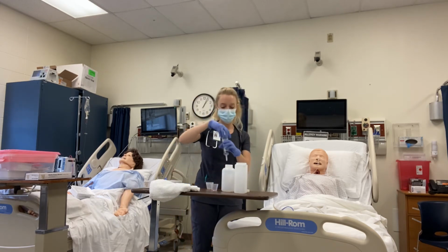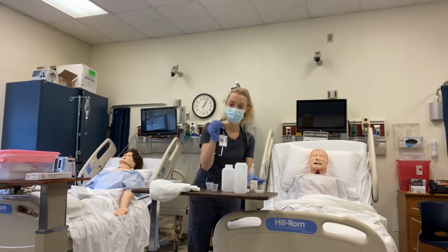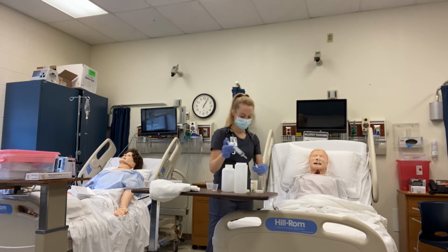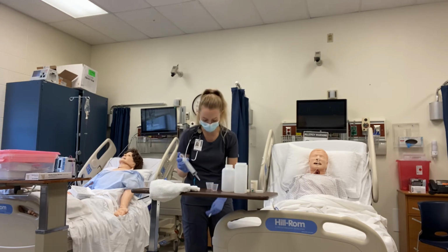I use a pH strip. I will unclamp the tube, aspirate contents, reclamp the tube, and test the pH to make sure that it's in the stomach before I administer the med.